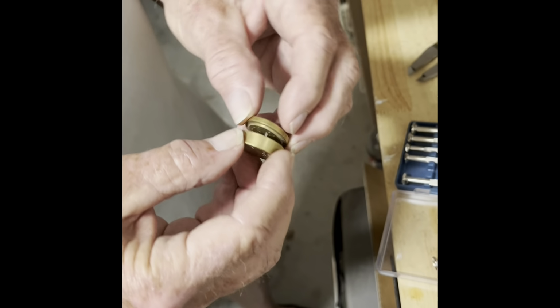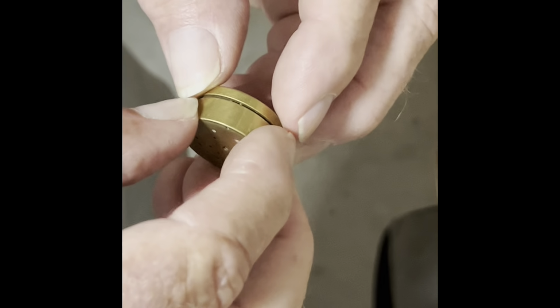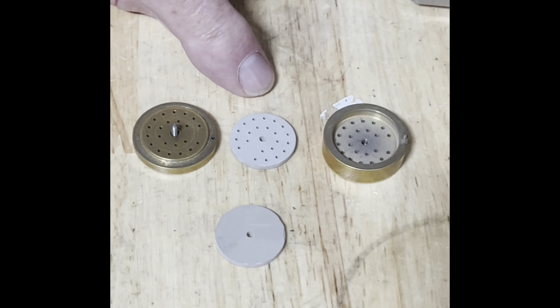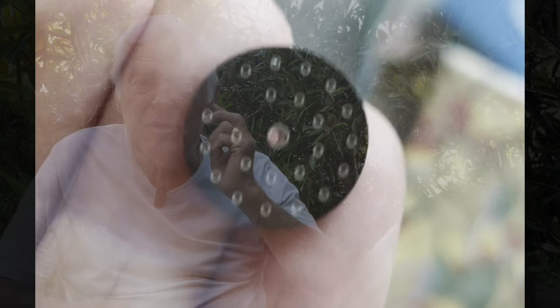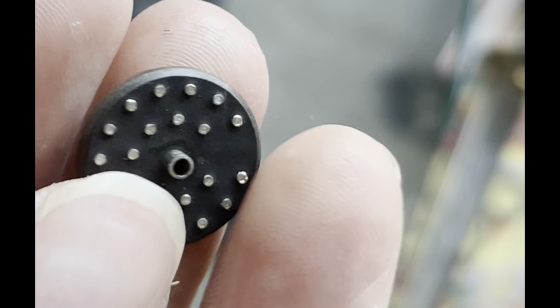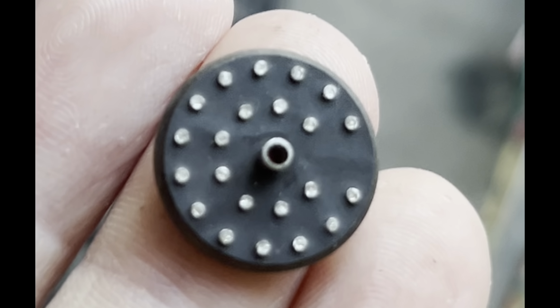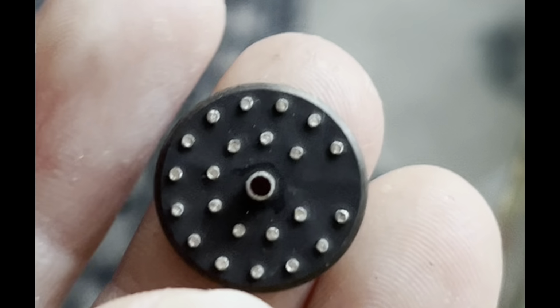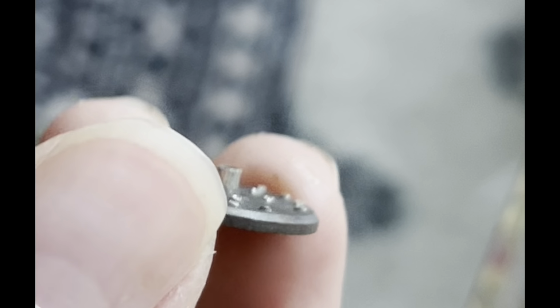So anyway, this worked, and then I made a jig to drill the holes. I got the drawing for the plotting of the 22 holes, and so I made this jig and put each one in a jig and drilled it, and they got them fired and it worked. But because they needed some means of attaching a wire, they put a 1 millimetre diameter platinum pin in each one, and once the ceramics shrunk 17% in the firing process, it shrunk around these platinum parts and actually formed a hermetic seal.